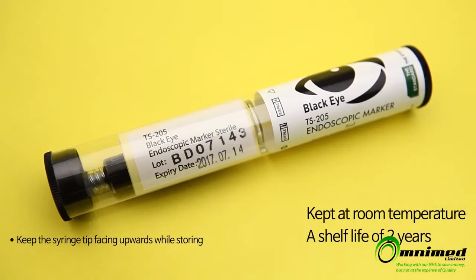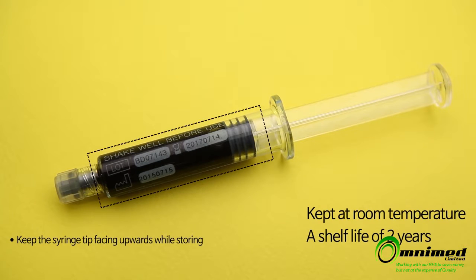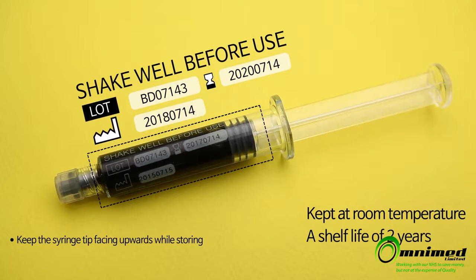Black Eye is kept at room temperature. It has a sufficient shelf life of two years. Shake well before use.